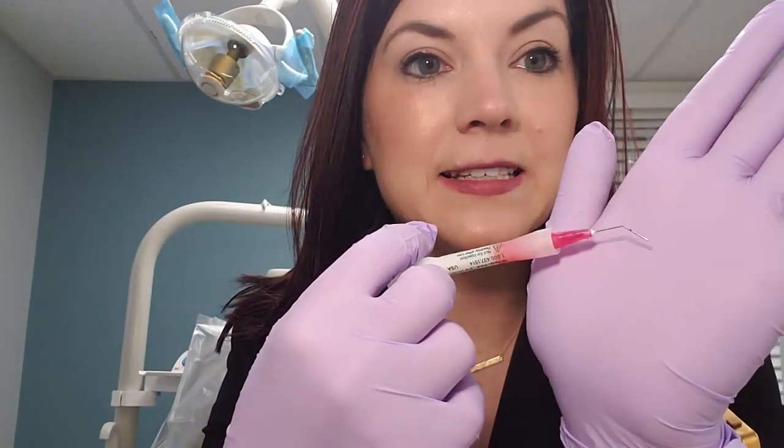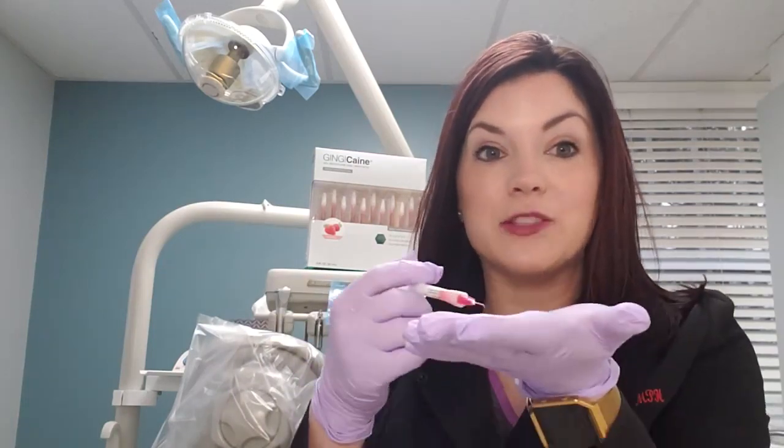It has a micro needle tip that is designed with a black mark on it — that's a 7mm mark. So when you're treating deep periodontal pockets, you're going to be able to be more effective and know how deep you're going. In addition to that, it's a round edge, so it's not going to poke or tear at the sulcus of the patient — no damage or trauma to the tissue, which is great.